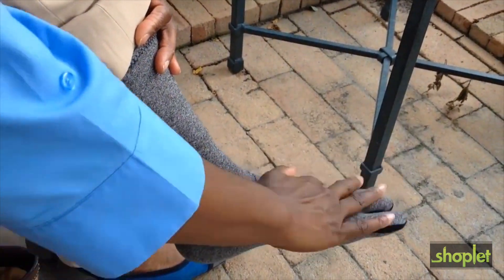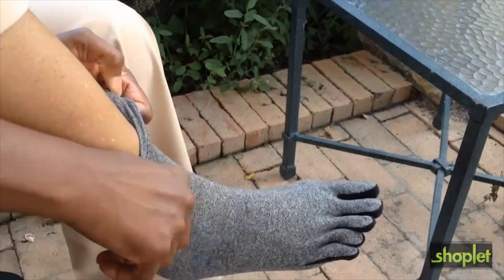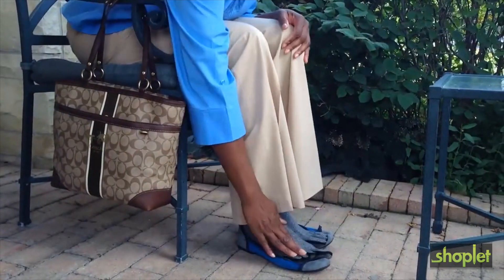Notice the webbing between each toe? It helps the sock conform to your toes and aids in compression. Arthritis socks are not made with natural rubber latex and come as a pair.